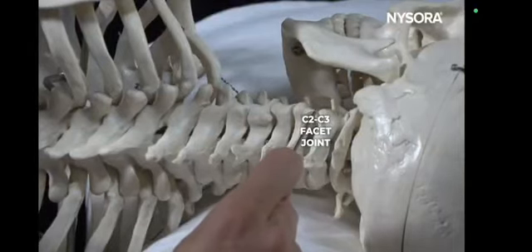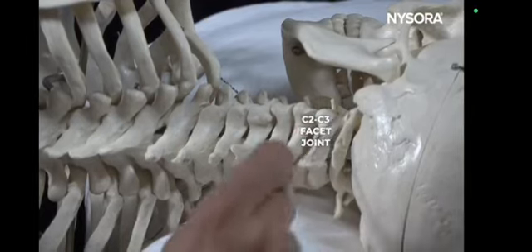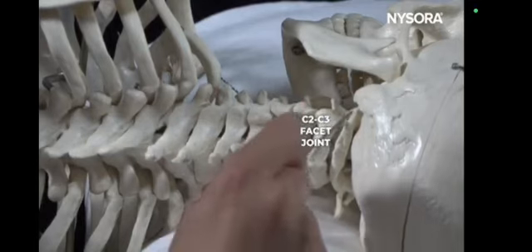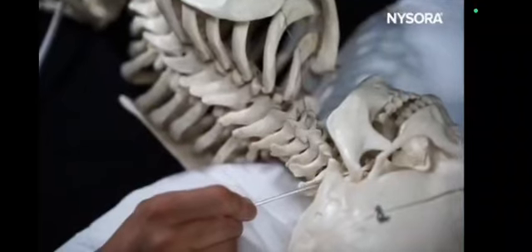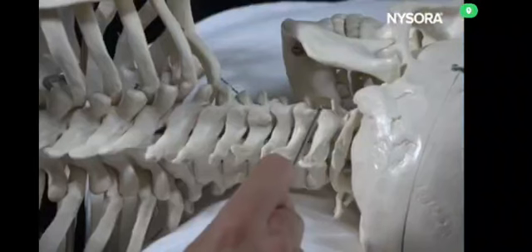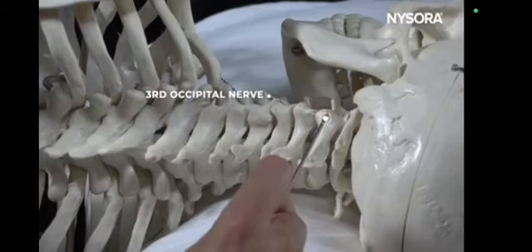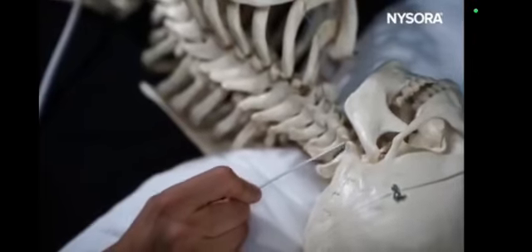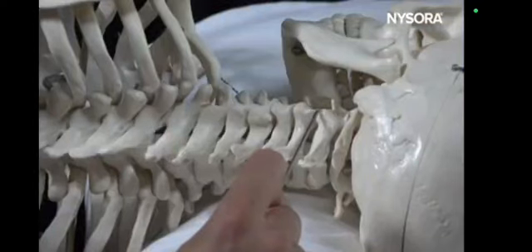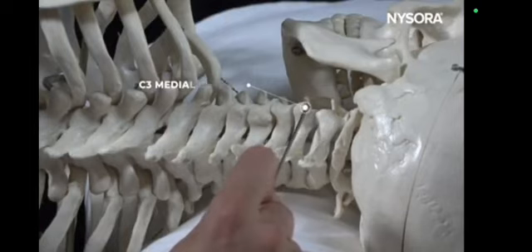This is the first joint that will be visible on the ultrasound, because C1 is just a ring and it becomes very difficult to actually identify the C1-C2 joint on the ultrasound in the lateral position. So your first visible joint will be the C2-C3 joint. At the C2-C3 joint, the nerve structure located superior to the joint is the third occipital nerve. Then you have the peak, which is the C2-C3 joint, and you have a trough, which is where you will have your C3 medial branch.